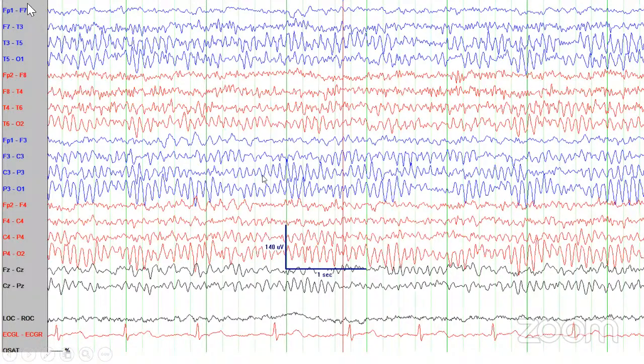Here we have frontal, temporal, occipital, the most lateral group of electrodes, placed anterior to posterior. Again on the right side, frontal, temporal, occipital, the most lateral group. This is the fronto-central, parietal, occipital, the left-sided parasagittal electrodes, anterior to posterior, and similar on the other side.